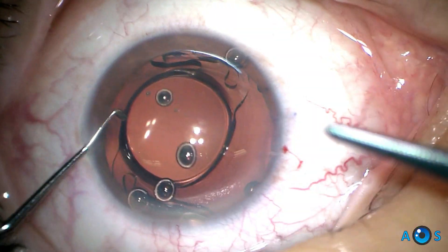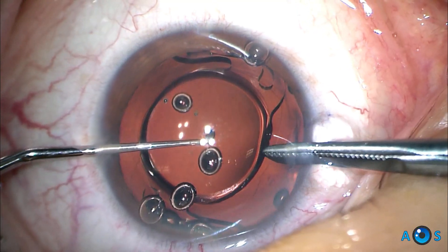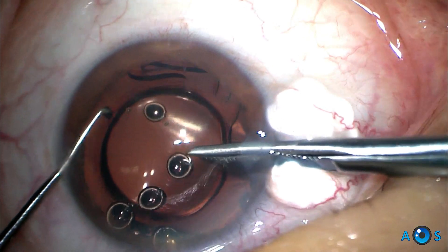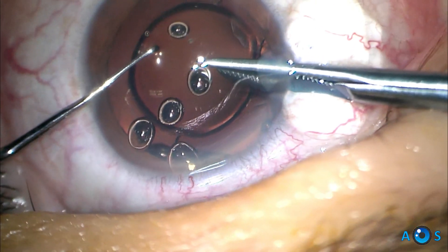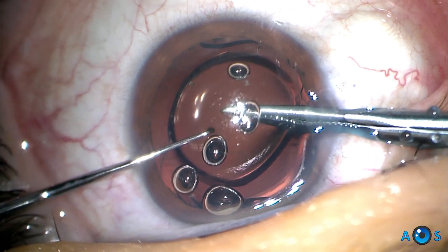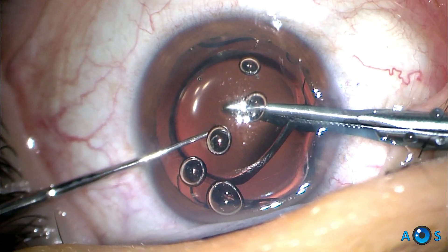The critical step in this surgical technique is to create a slice on the IOL optic. Therefore, the cutting scissors are introduced through a 2.4 mm corneal incision placed in the steepest meridian, while a chopper is placed through an opposing corneal side port, and maneuvered to provide counter-traction, while the scissors are gently advanced passing the center point of the optic.